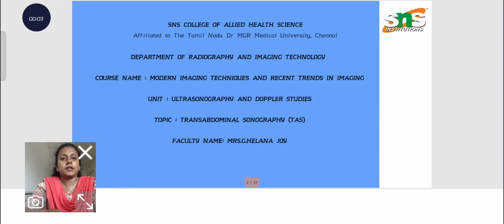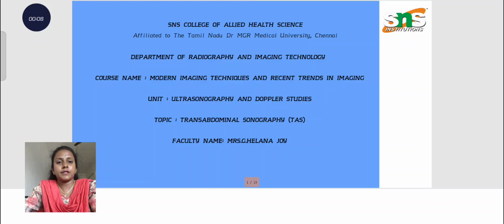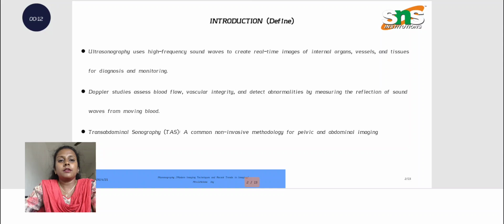Hi all. In this video, we are going to discuss the transabdominal sonography procedure, which is done under ultrasonography and Doppler studies. Ultrasonography uses high frequency sound waves to create real-time images of internal organs, including vessels and tissues, for diagnostic and monitoring purposes. Doppler studies also assess blood flow and vascular integrity, and detect abnormalities by measuring the reflection of sound waves from moving blood.